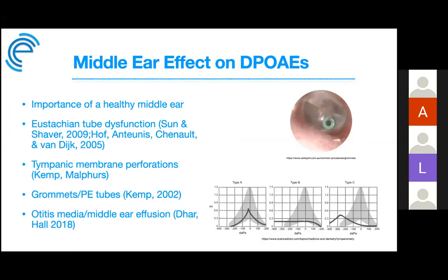Obviously, otitis media and middle ear effusions are going to cause a reduction in the OAE amplitudes, and perhaps absence of the amplitudes, depending on the extent. But as with most of the middle ear conductive components, after the treatment or the surgery, if the residual conductive loss is very small and the cochlea is normal, we are going to have OAEs again.